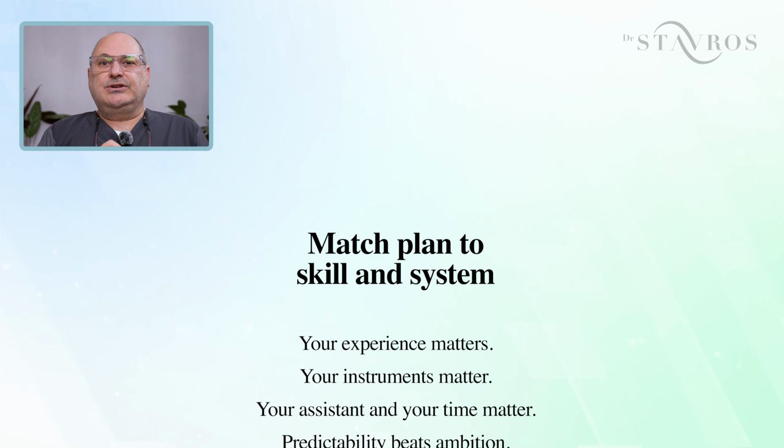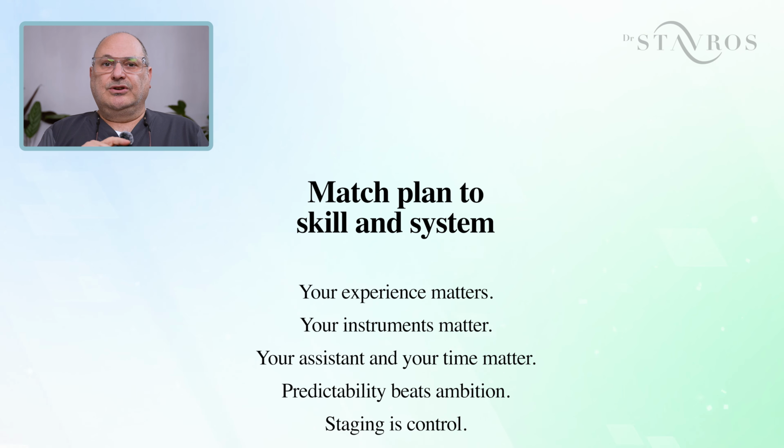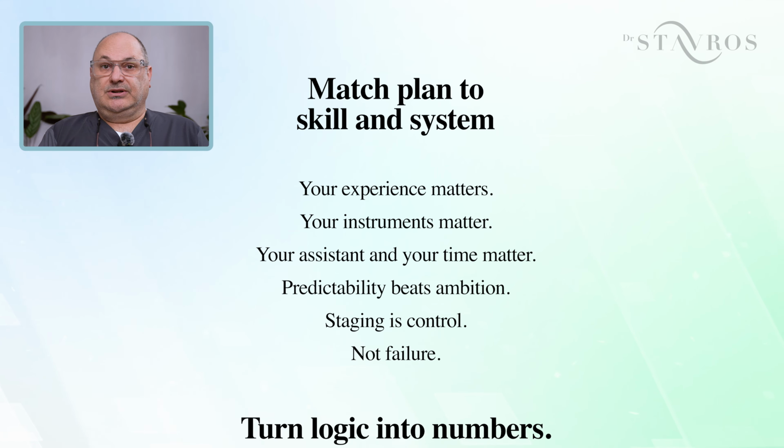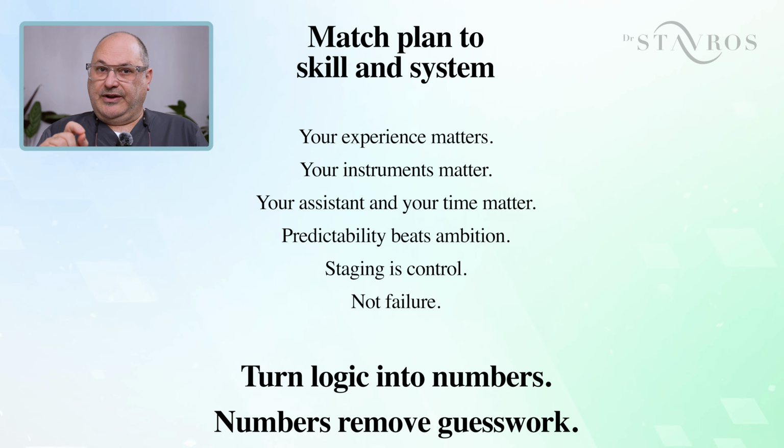Option 3 would be simultaneous GBR and placement, if you can predict space maintenance and stabilization, and then if defect allows it. Option 4 would be a staged GBR and then placement. This is what we do for large defects. Also, we do the same if we have poor tissue, low vascularity, or high systemic oxidative stress. Option 5 would be delayed loading, if risks are high or you need a short operation time. So, match plan to skill and system. Your experience matters, your instruments matter, your assistant and your time matter. Predictability beats ambition. Staging is control, not failure.